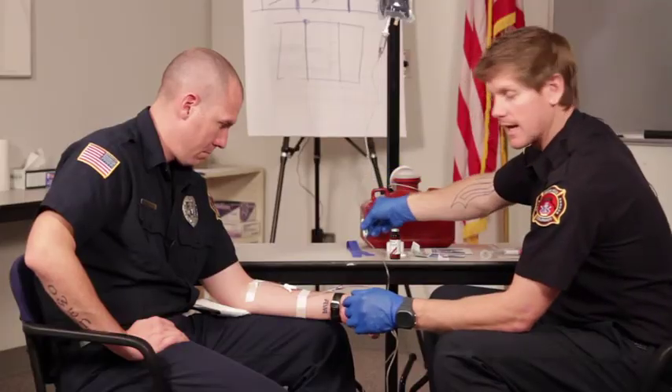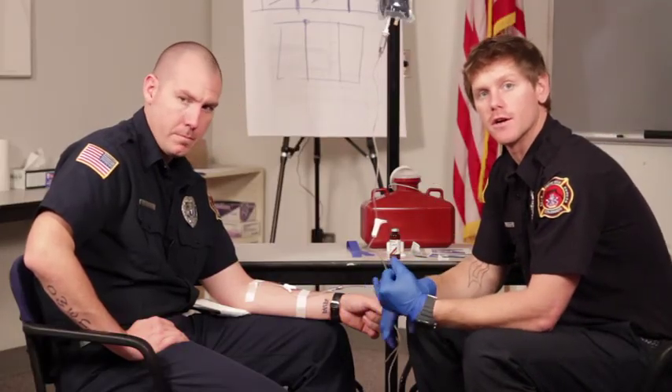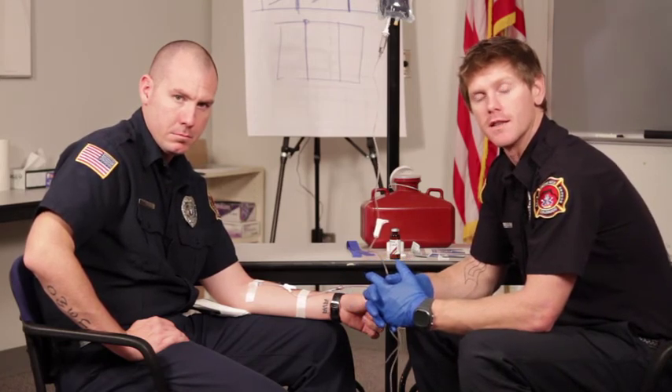Once you're done with the medication it's important to reassess your patient. You want to make sure you're getting the desired effects and that you're managing any side effects as well. And this concludes the IV bolus medication administration.